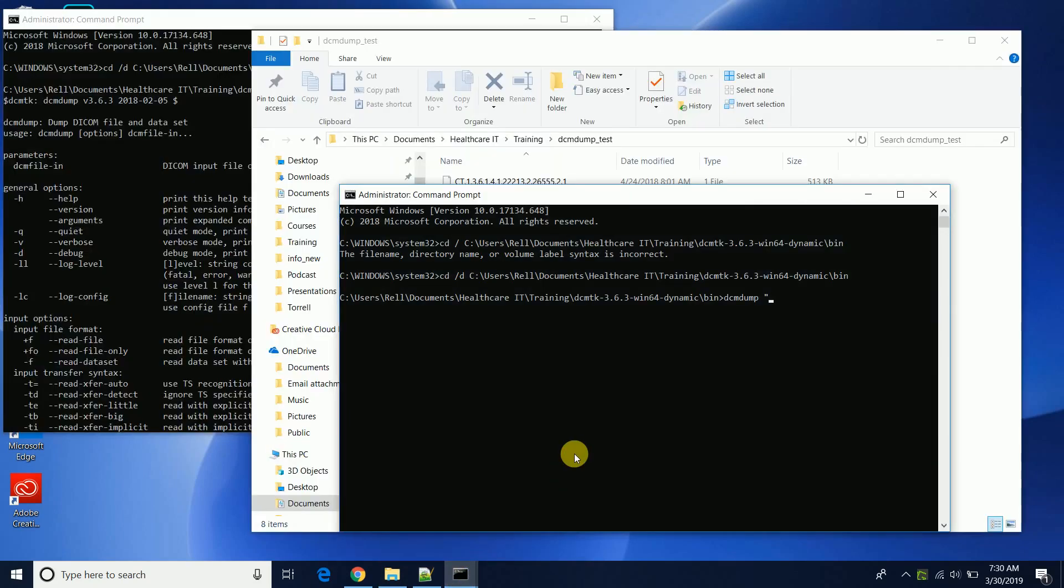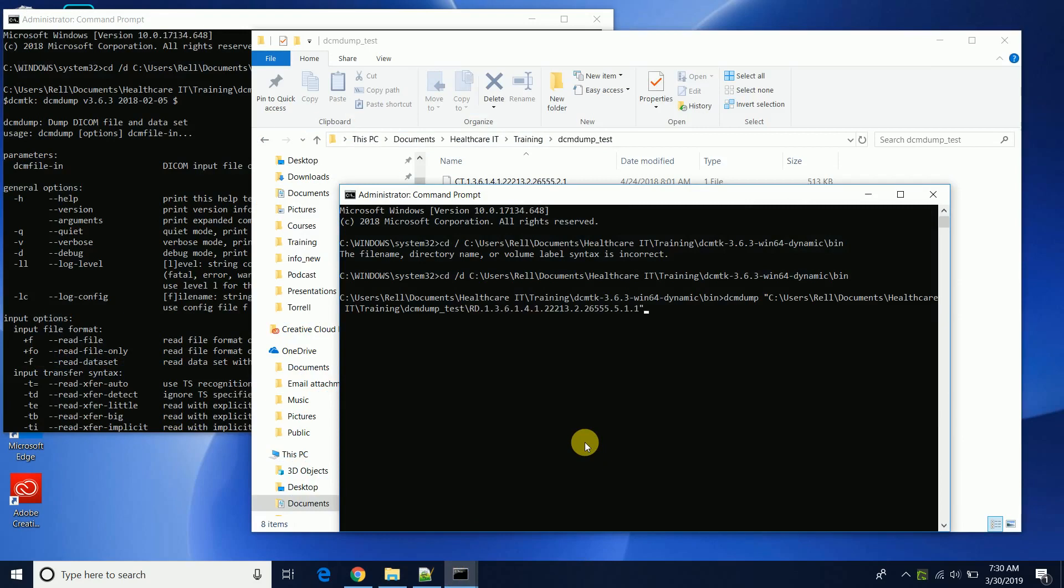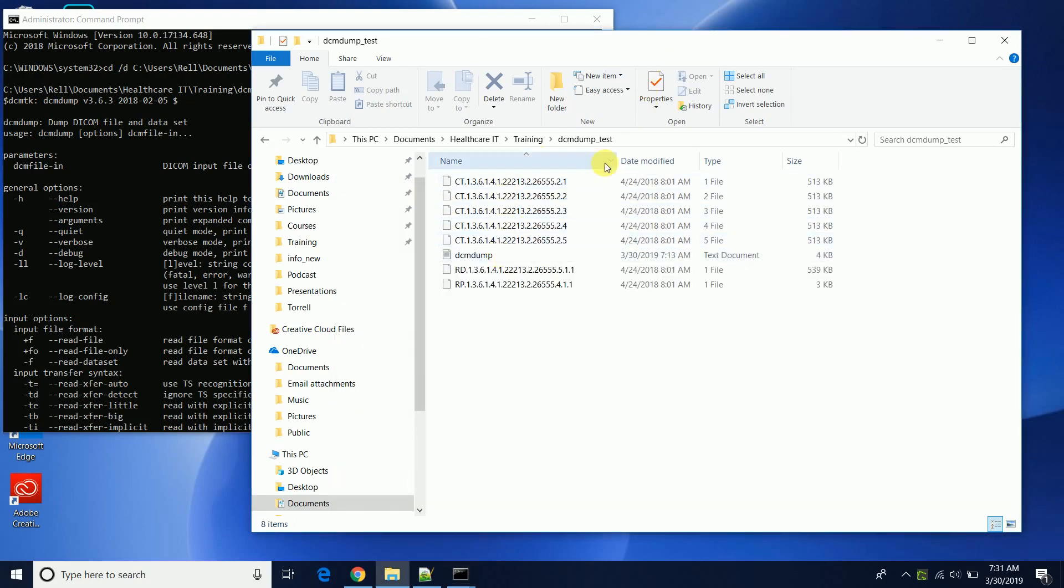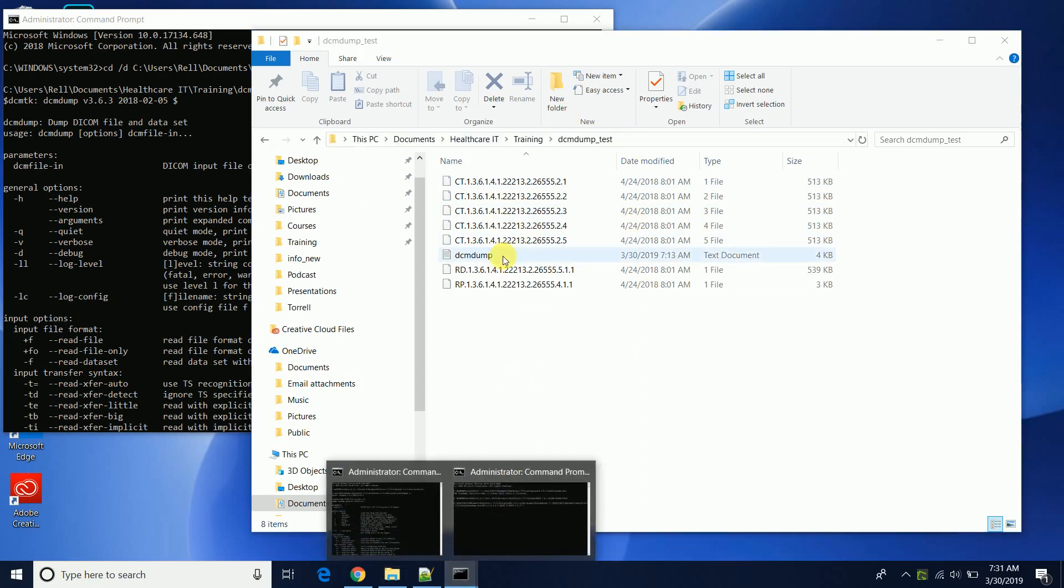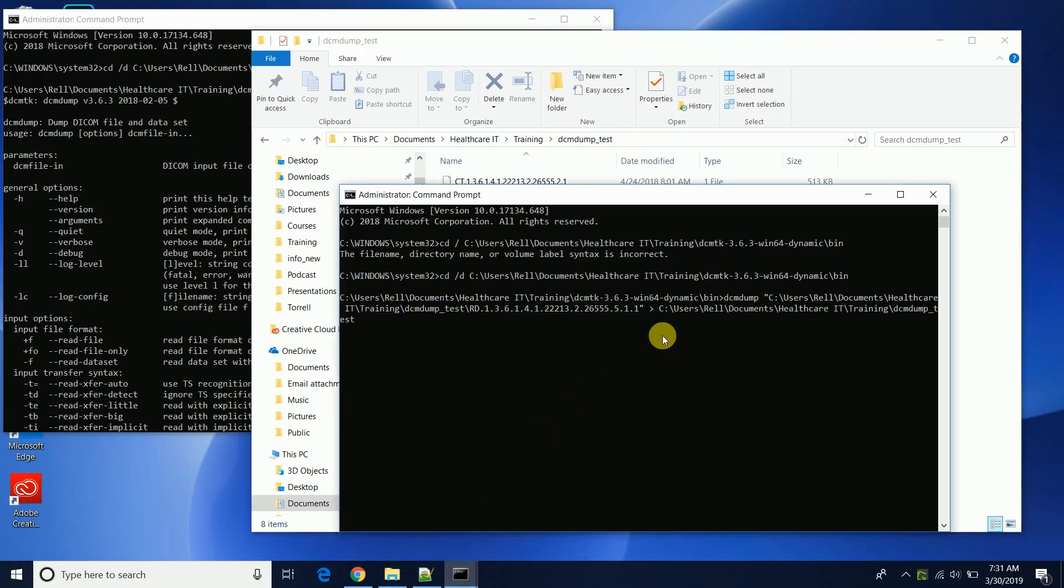Put it in quotations and we will just pick one of these DICOM files, doesn't matter which one. And then we also want to output because this is going to dump all of the DICOM tags and contents. If we do it like this, it's going to dump it into the screen and to command prompt, but we want to just send it to a file. So we want to just use this symbol here and we want to send that output to this file, DCM dump text file.